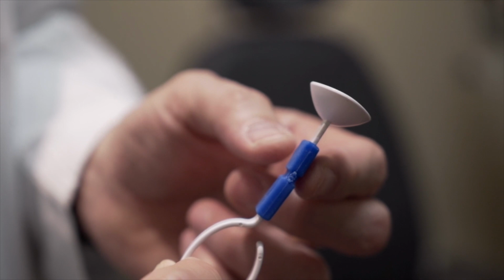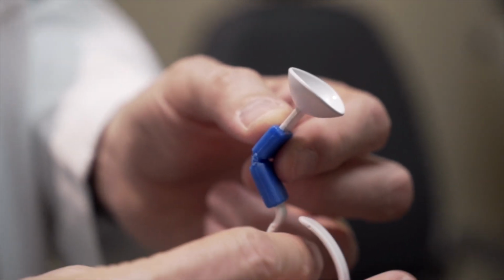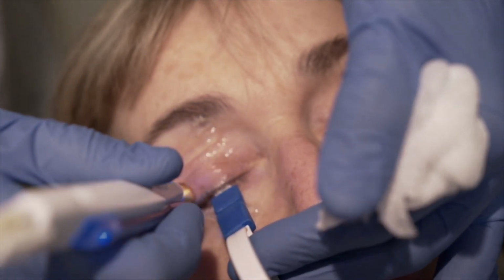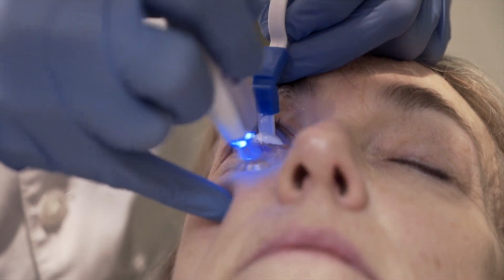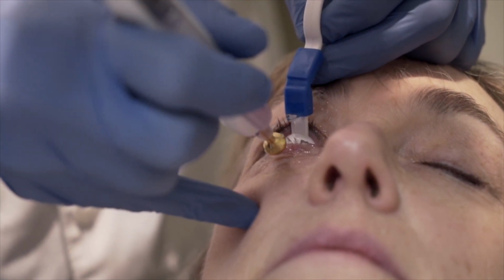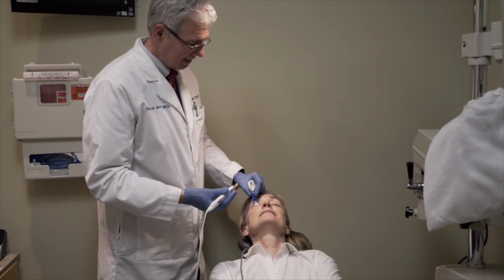Bend the shield handle in the opposite direction of the treated lid so as to expose that lid and apply a slight back pressure, anchoring the handle on the cheek or forehead as indicated. Begin by applying minimal pressure with the radiofrequency handpiece and maintaining light counterforce with the shield. Activate the radiofrequency tip into the cut mode and systematically move the handpiece horizontally across the lid margin, encouraging the patient to provide feedback on any discomfort.